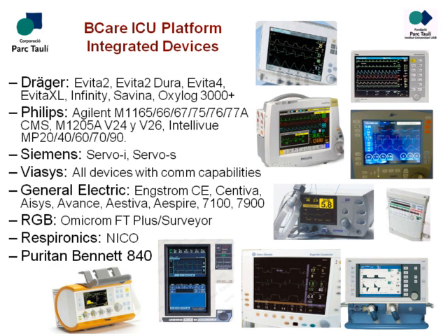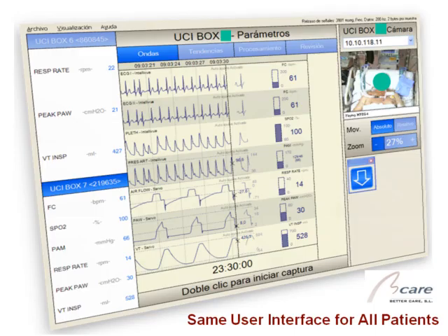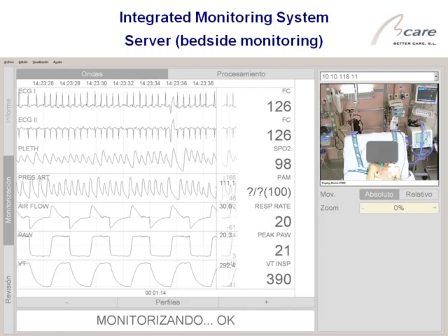We have integrated digital signals from all ventilators and monitors through a common user interface, and we also use video. Our idea is that if we integrate this through complex program systems, we can have information on what's going on all the time, 24 hours, 7 days, with waveforms. So we analyze waveforms automatically.